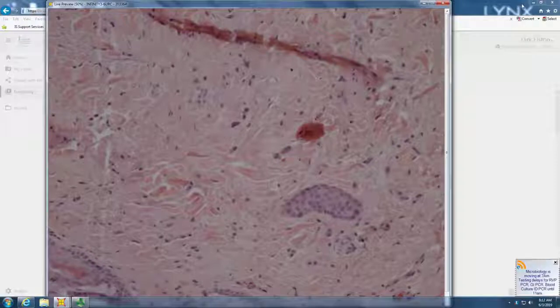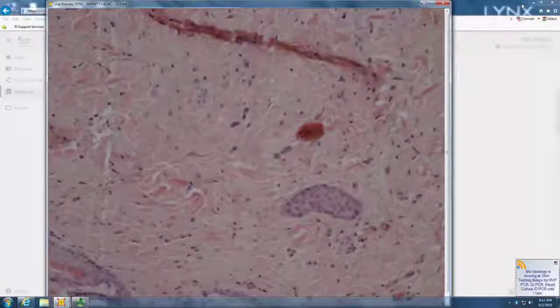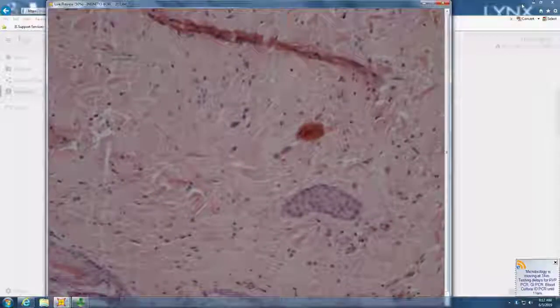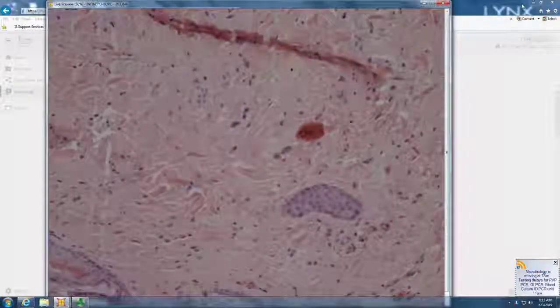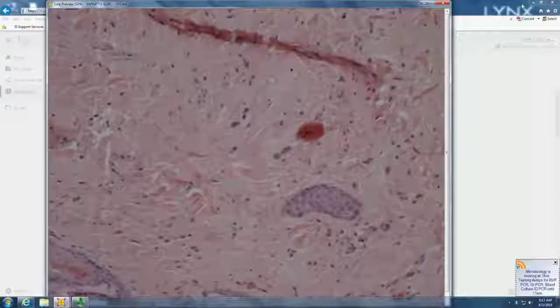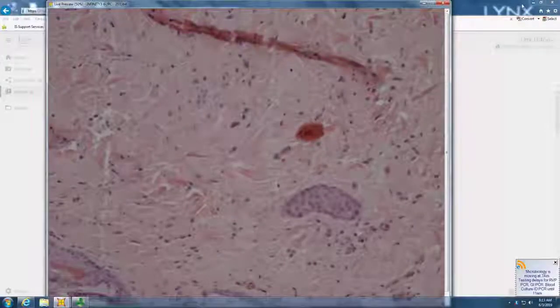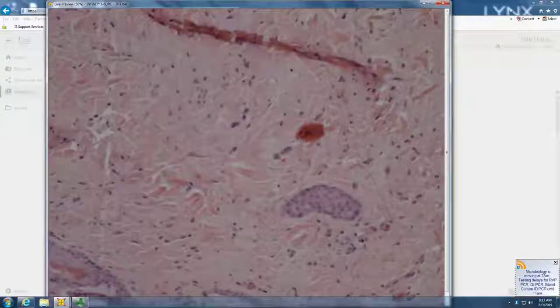Subtle, but it's not a normal dermis, right? It's a sclerotic busy dermis. So your question then is, what are those cells? Could this be desmoplastic melanoma? And breast is one of those things that does a subtle busy dermis with sclerosis, and this turned out to be breast carcinoma. And with that, I think we are done.